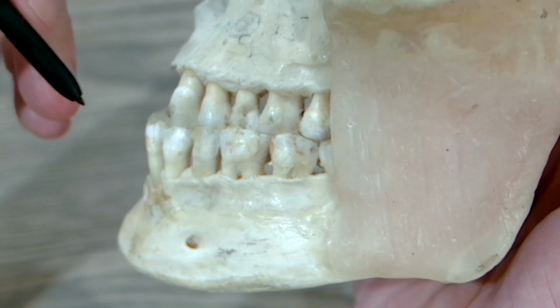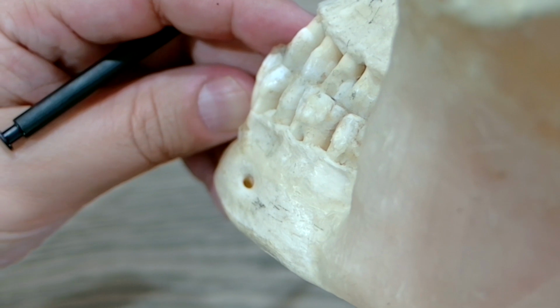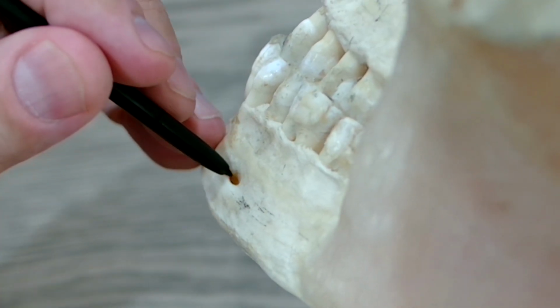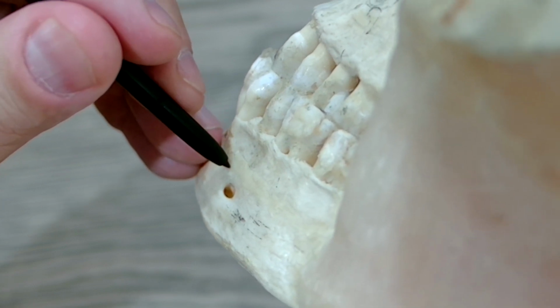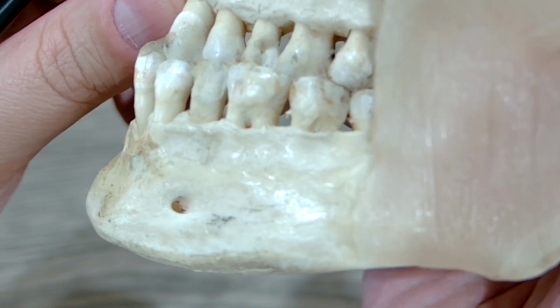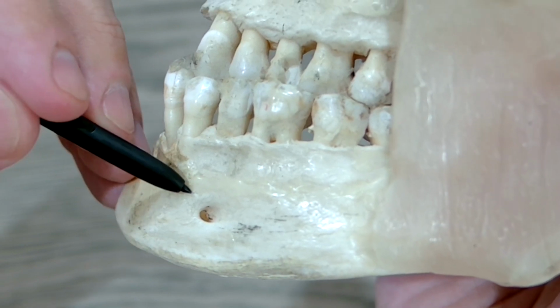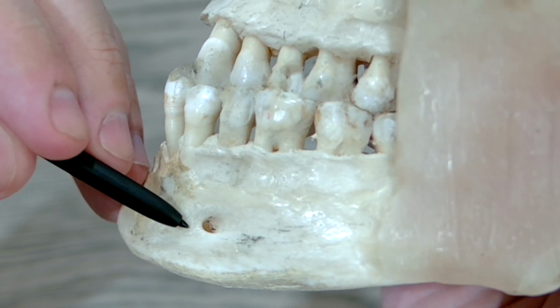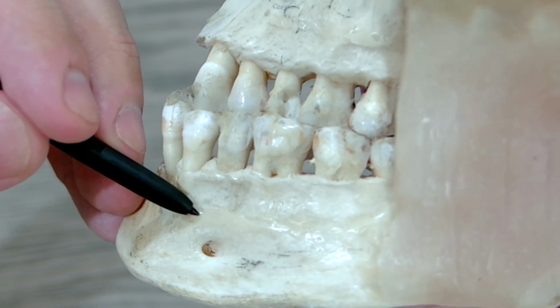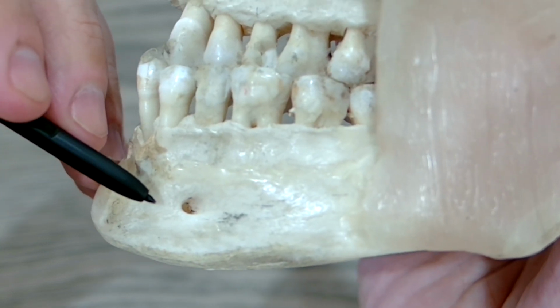What's interesting is if you look at the mental foramen here, you can see it goes in deep and then it makes a loop anterior and then it goes up. 61% of the time, that anterior loop will go between 0.5 millimeters to 6 millimeters forward and then curve around. The panel will typically not show this.